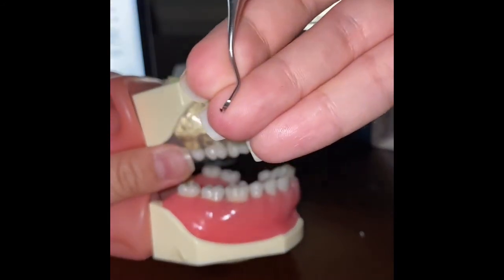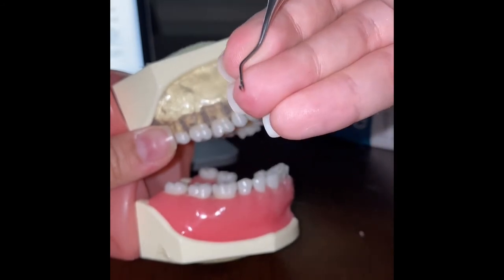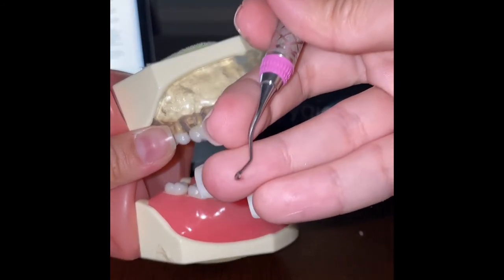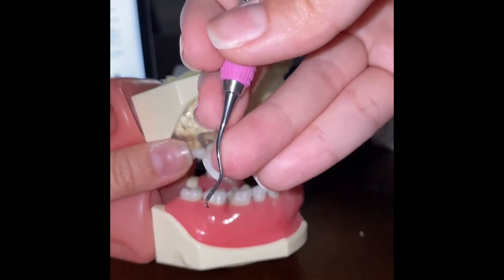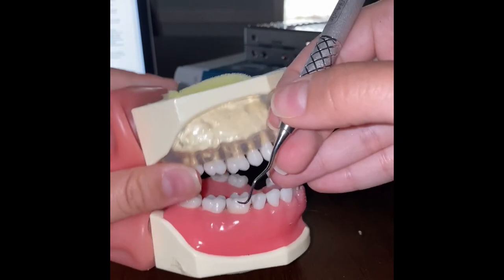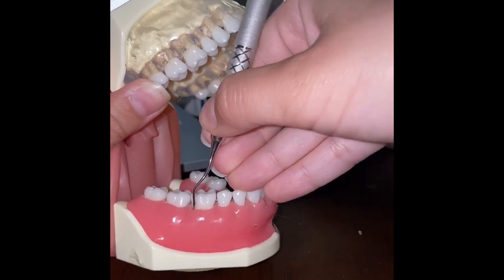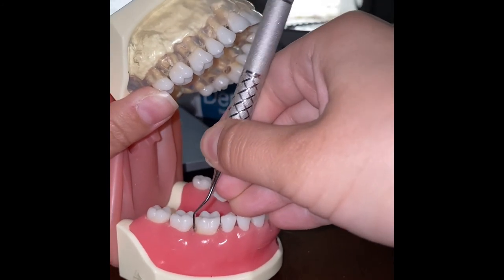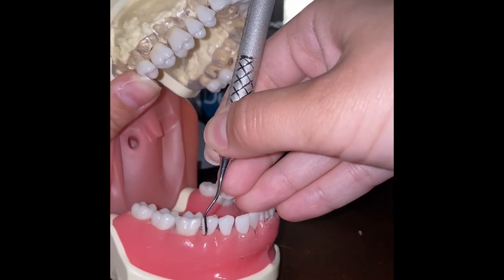We're looking for the lower blade on the correct working end. We begin at the distal line angle of tooth 30, insert, open, and activate. We work fully interproximal, then do the same for tooth 29.